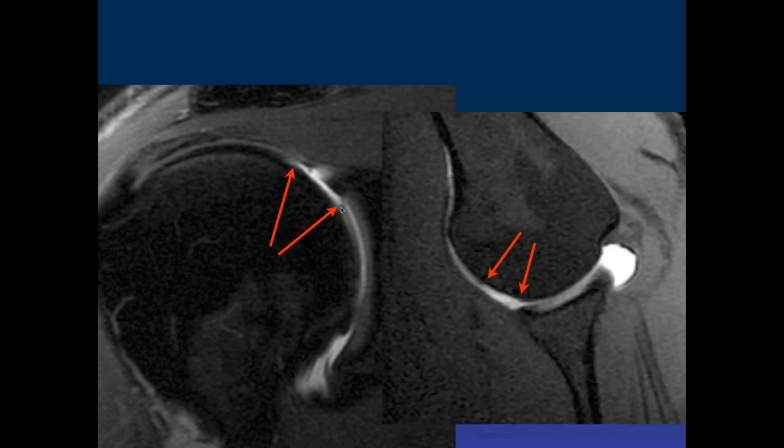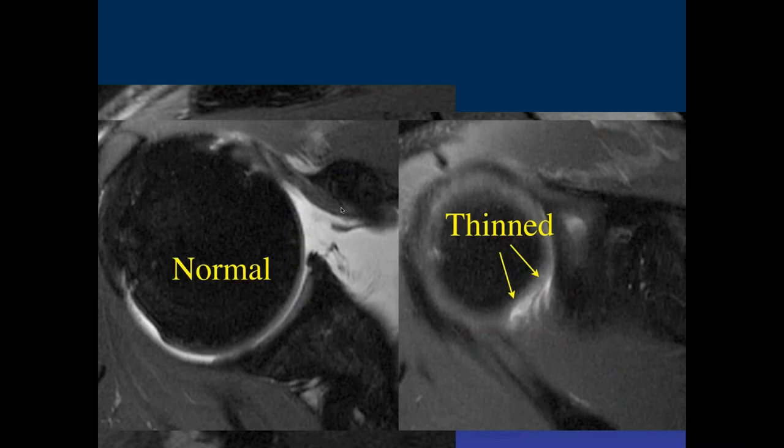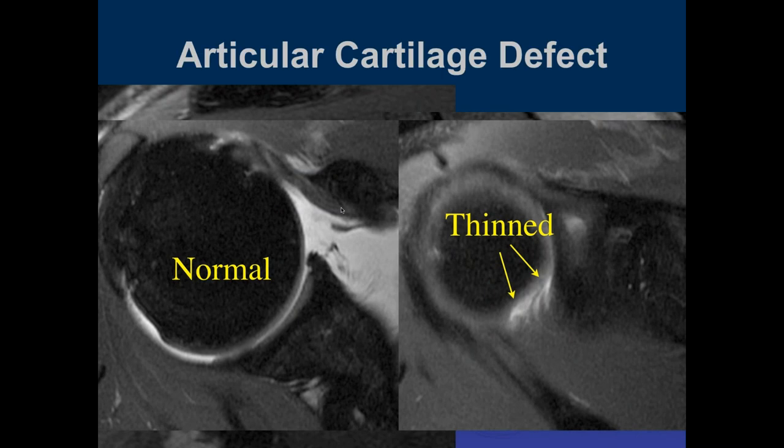What's concerning here is, notice here we can see articular cartilage up to that point. And then there's a big defect. I just kind of want to point this out, that these cartilage defects can be a little bit subtle. So when you're looking at these, it's important to take time to specifically look for the cartilage in the humeral head. Otherwise, these full thickness defects, which aren't subtle at arthroscopy, can be easily missed on an MR study. And it just kind of shows the difference here. Okay.